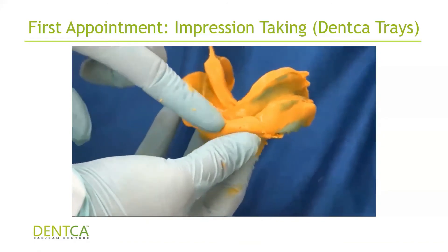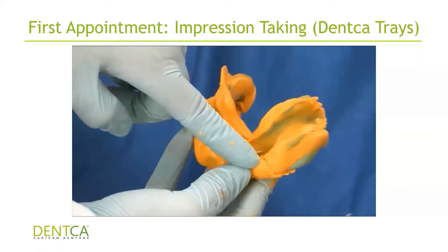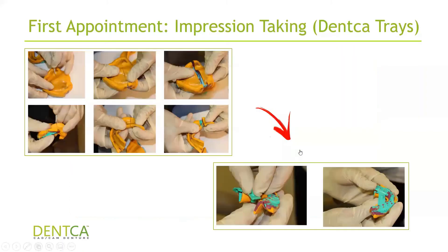That's what it looks like when you're done. Make sure all the borders look okay and everything is fully captured. You do upper and lower and then you're going to separate the trays. There's one cut for the upper and two cuts for the lower. When trimming the posterior attachments off the lower tray, make sure you relieve the lingual area from any impression material, because you're going to be putting a central bearing pin on the lower tray and you need to relieve the little notches where you'll connect the central bearing pin.